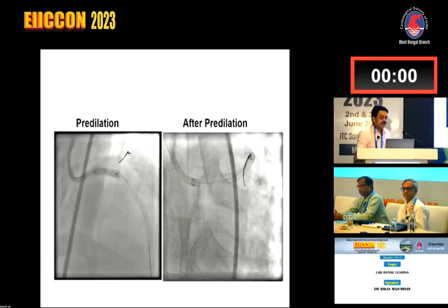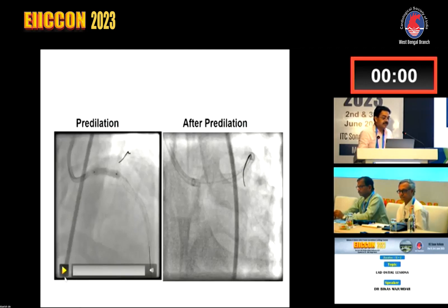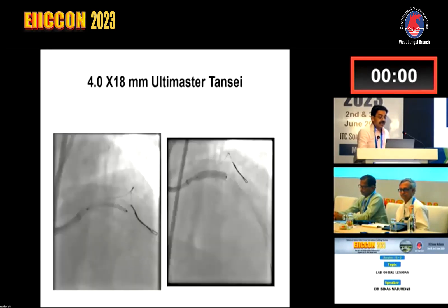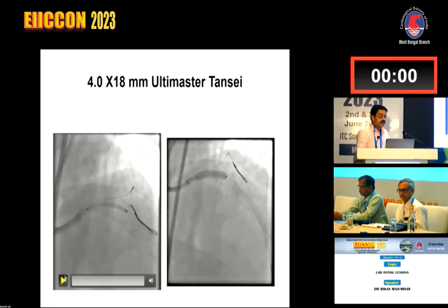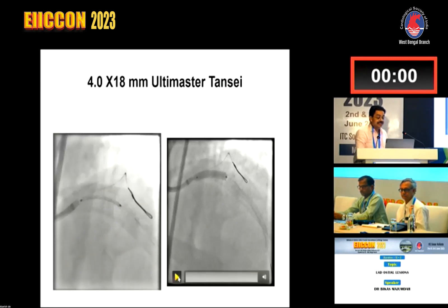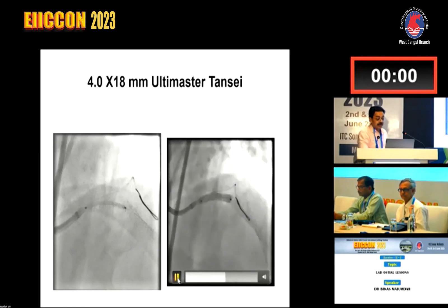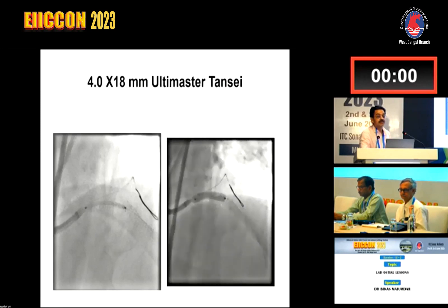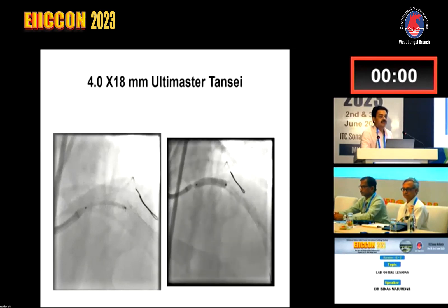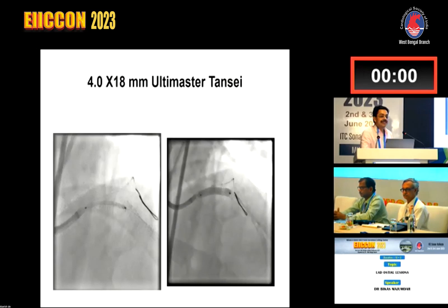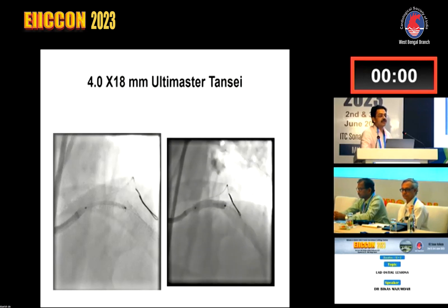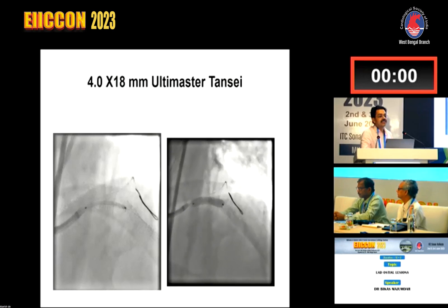The rest was straightforward — I pre-dilated with a balloon. And when choosing and sizing the stent, the key thing to remember is that the left main is often much bigger than the distal LAD where we are landing the stent. If you do IVUS, measure the intima-to-intima diameter and the media-to-media diameter at the distal landing zone. For example, if the intima diameter is 3 mm and media diameter is 4 mm, you choose a 3.5 mm stent for the distal part.